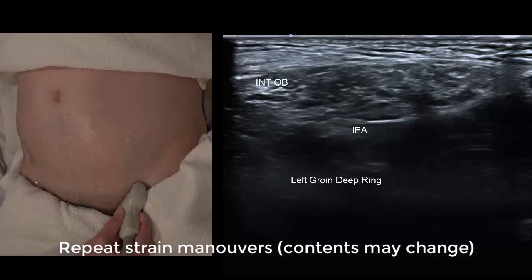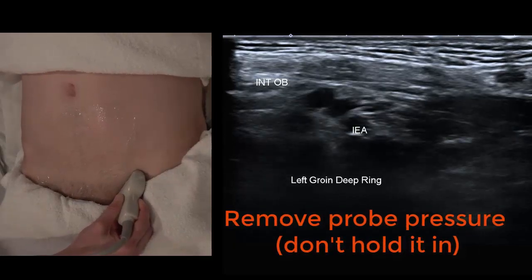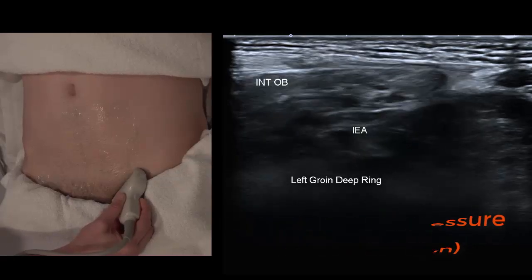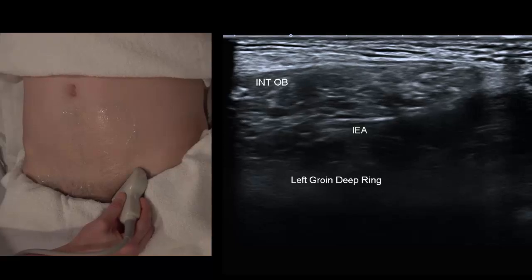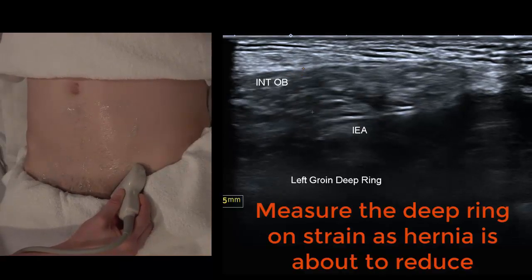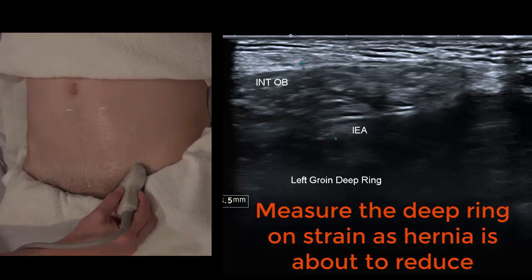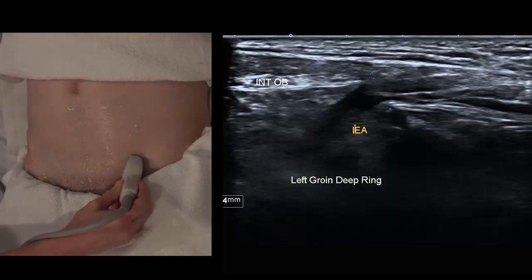One pitfall is you can push too hard and hold it in — you've got to be very light-handed. It's like you put the weight on the bottom of the probe but the top end of the probe has to almost lift off the patient's skin. We're going to measure that deep ring, which is always reported as the neck of the hernia. That size is important for the surgeon to pick the right size mesh or the right type of surgery.